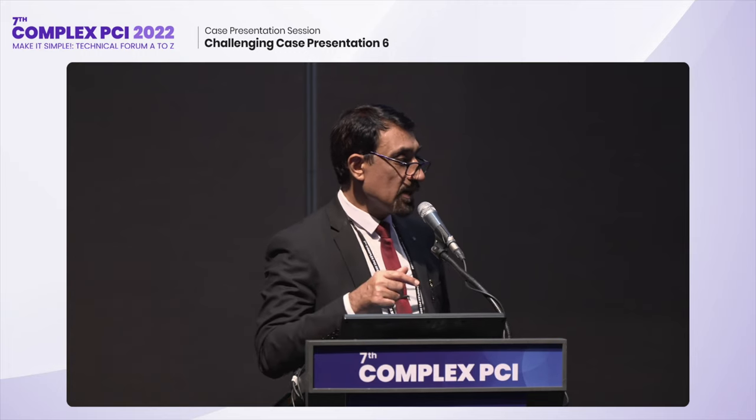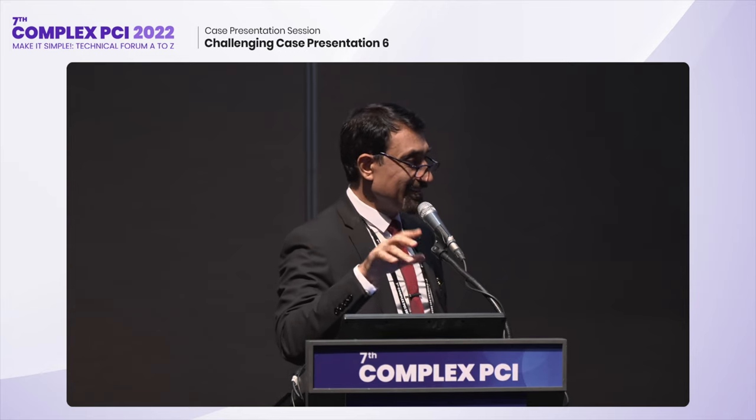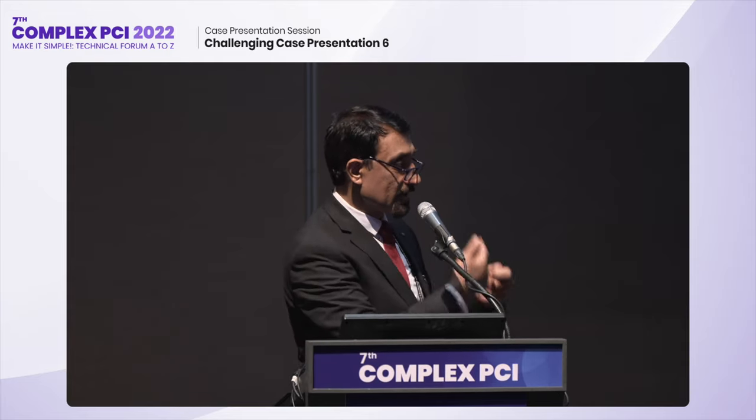So that's why the stent got dislodged in left main. If it could have been difficulty at the lesion site, I should have lost the stent at the lesion site. It was left main to LAD. So the guiding was hooking up. That's why we have to take the guiding out in future so that the stent is aligned.